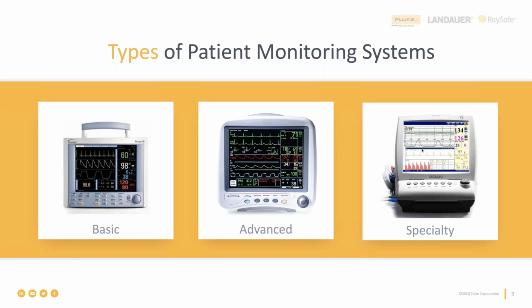The vital signs measured here are ECG, temperature, blood oxygenation, SpO2, and blood pressure. All these parameters are measured in a non-invasive manner, meaning it doesn't go in the human body. Blood pressure with a cuff, temperature with a thermometer that could be oral or dermal, and blood oxygen saturation with a pulse oximeter that goes on your finger or forehead, or for babies, their toe. There may be some variations here, but this is one general bucket of patient monitors.